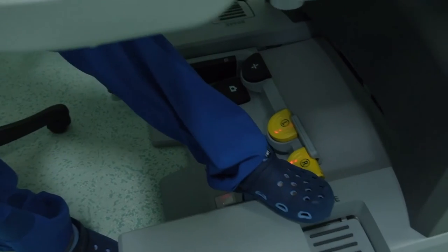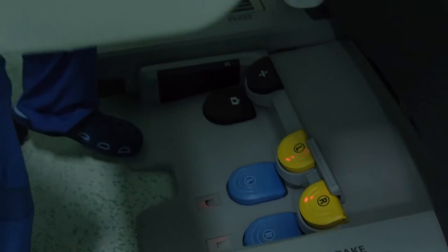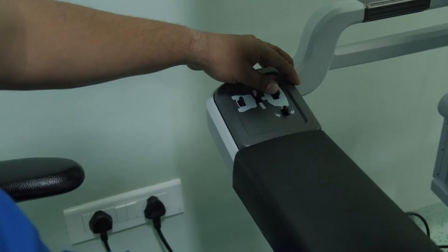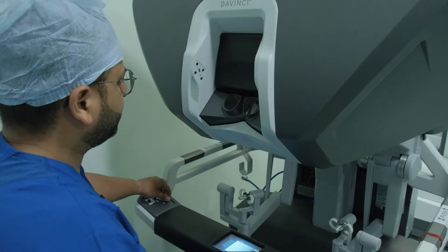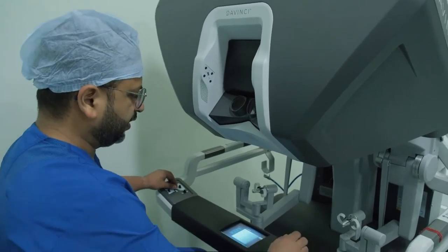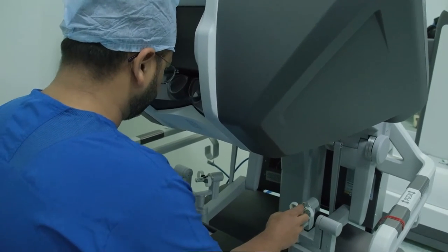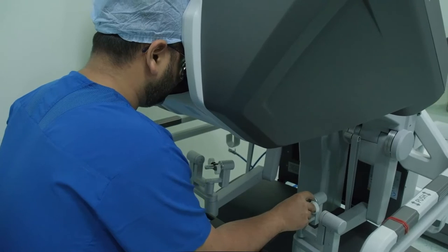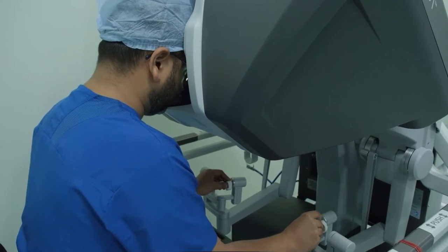It has a brake here which can be put on in order for this master console to stay where it is. These are the ergonomic controls of the master console which can be changed. According to your own height and the chair height, you can raise the height and tilt it forward and backward depending on how comfortable you want it to be. Also, you can raise the height of the handrest. If I am adjusting this console according to my height, I am going to use these controls, and I can bring the foot pedal forward and backward and see for myself, and tilt it back so that my back is straight and I am looking directly down into the viewer.